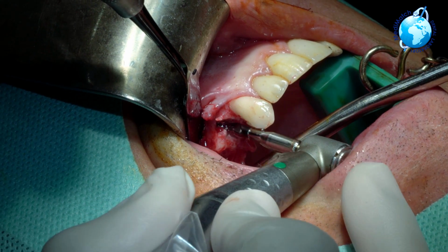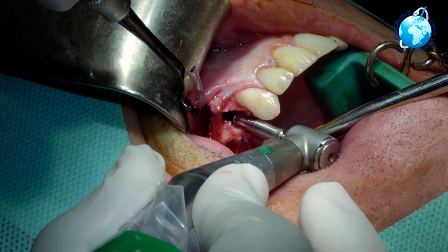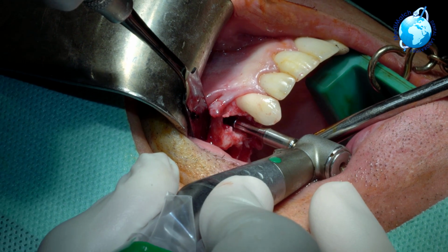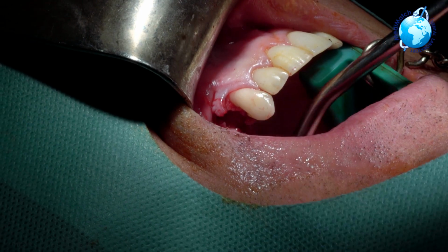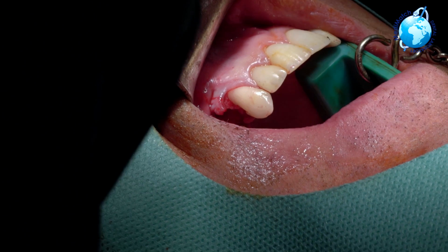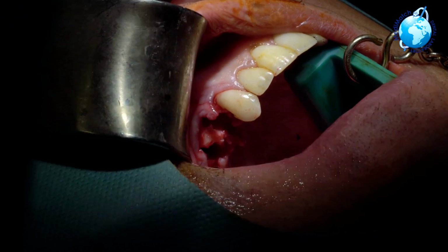Cool. So there's a 2.8 drill. Really don't want to do any more than that. Checking where the crestal position of that implant's going to be. I'm quite happy with that. Open wide, Alan. That's where we're going to be. Awesome. Right, so guys, I need the implant now. We need a Megagen 3.5 by 15, please. Straight in with a 2.8.